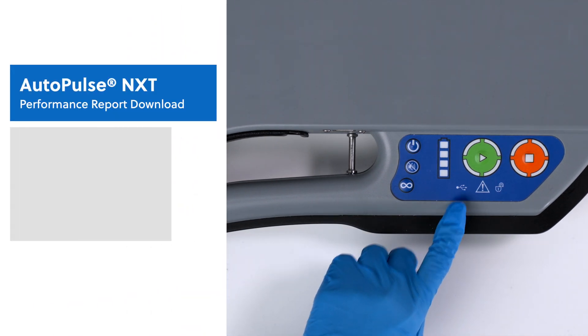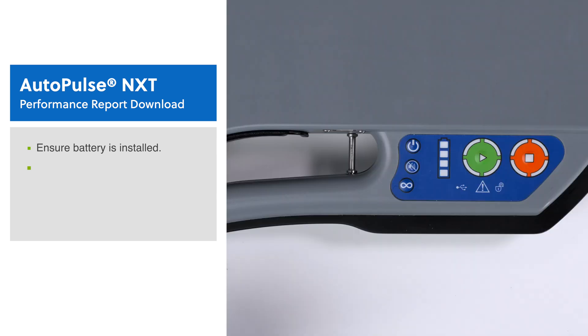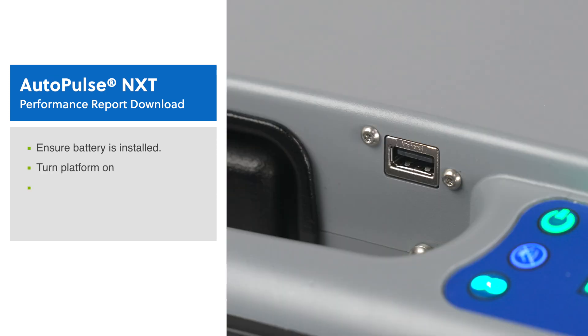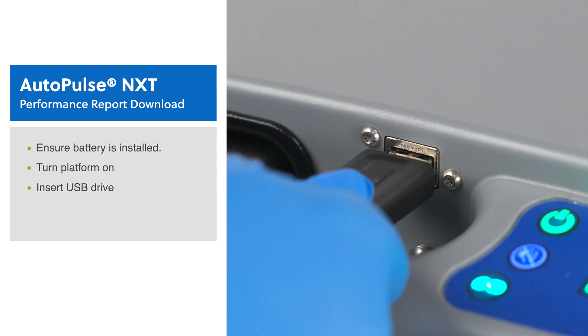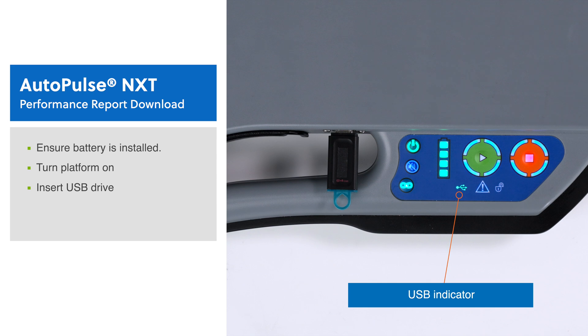To download a performance report, first ensure that there is a battery installed in the platform. Next, turn the platform on. Insert a USB thumb drive into the USB port. The USB indicator should start flashing. The USB indicator flashes green when transferring session summary data from the platform to a USB drive.